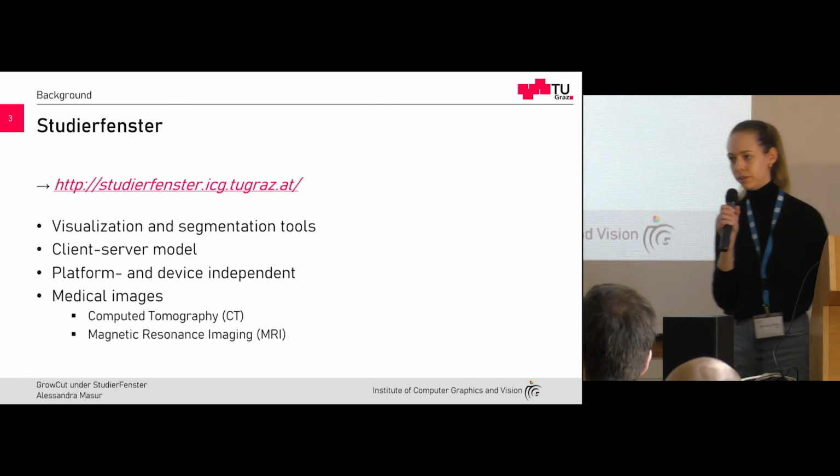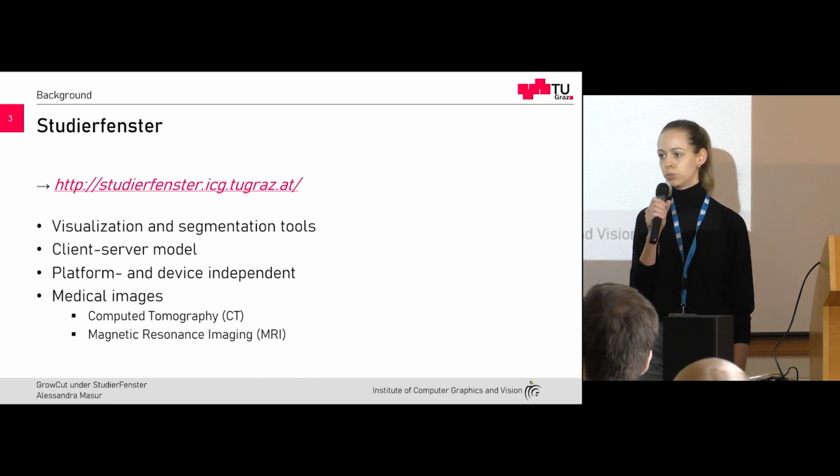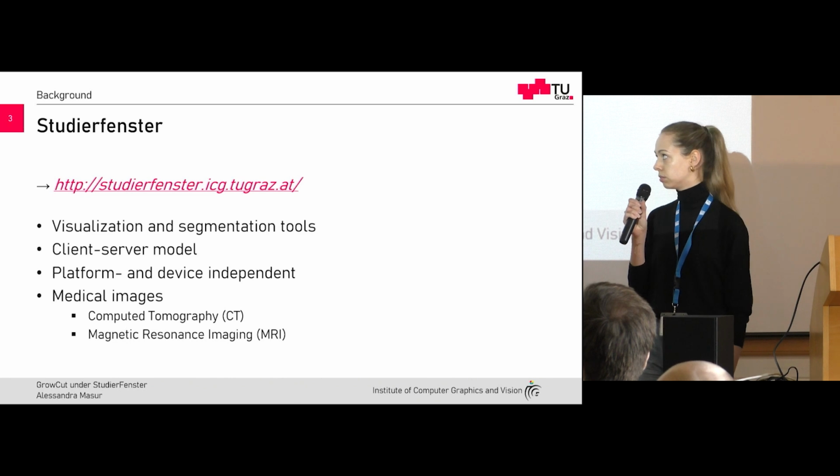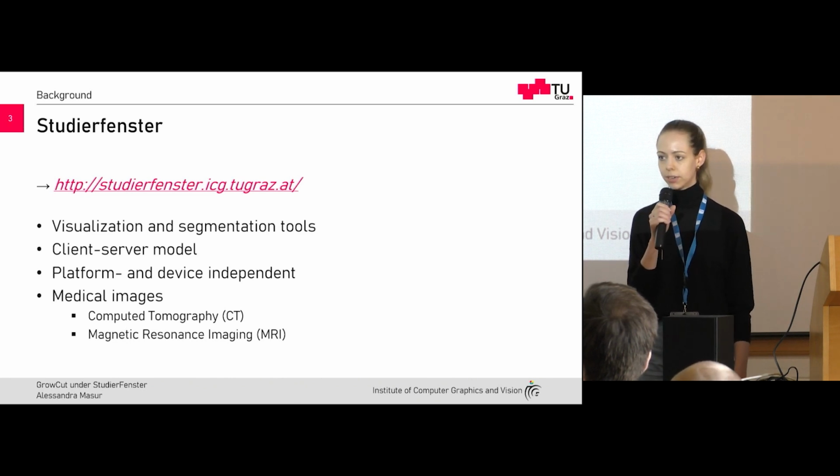So let's start right away with the background. My goal was to add the GrowCut segmentation algorithm to the StudierFenster website. But what is the GrowCut and what is the StudierFenster? So the StudierFenster is a website. It was done in previous work at the Technical University in Graz.